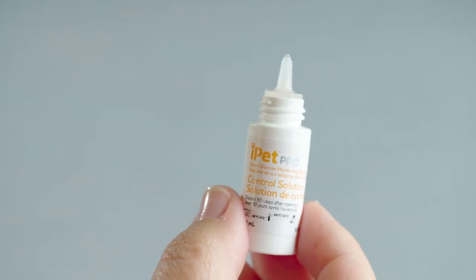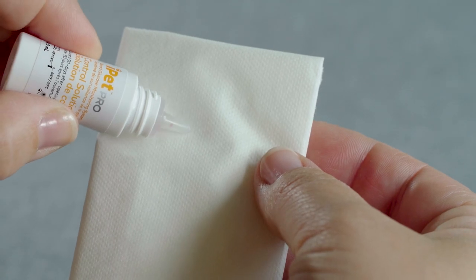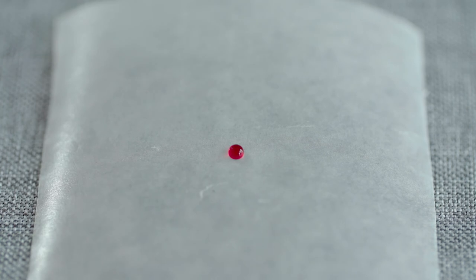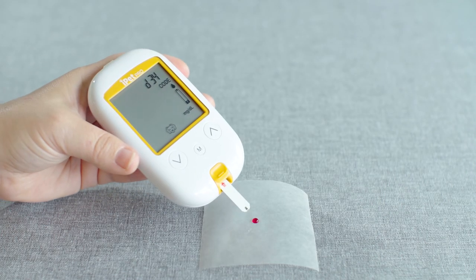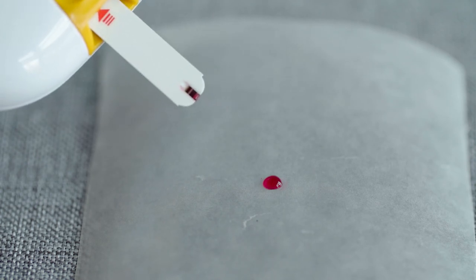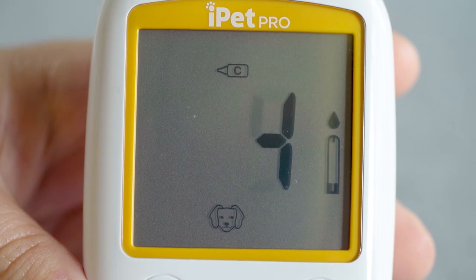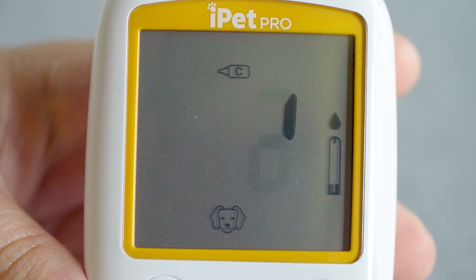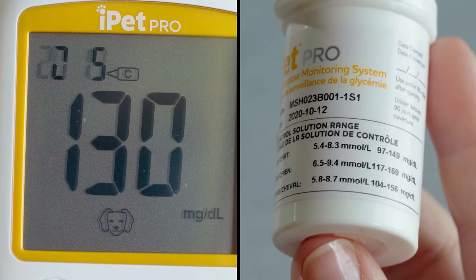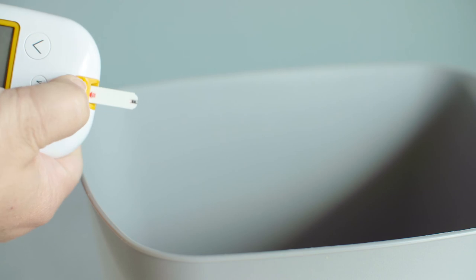Open the control solution bottle and wipe off the top with a clean tissue. Squeeze the bottle and discard the first drop of solution. Squeeze a second drop onto a non-absorbent surface, such as wax paper, and insert the target area of the test strip into the solution, being sure to fill the entire test strip confirmation window. A beep will confirm the meter is analyzing the solution. Results appear after 5 seconds. Compare these results to the control solution range found on the test strip file. Discard the test strip.